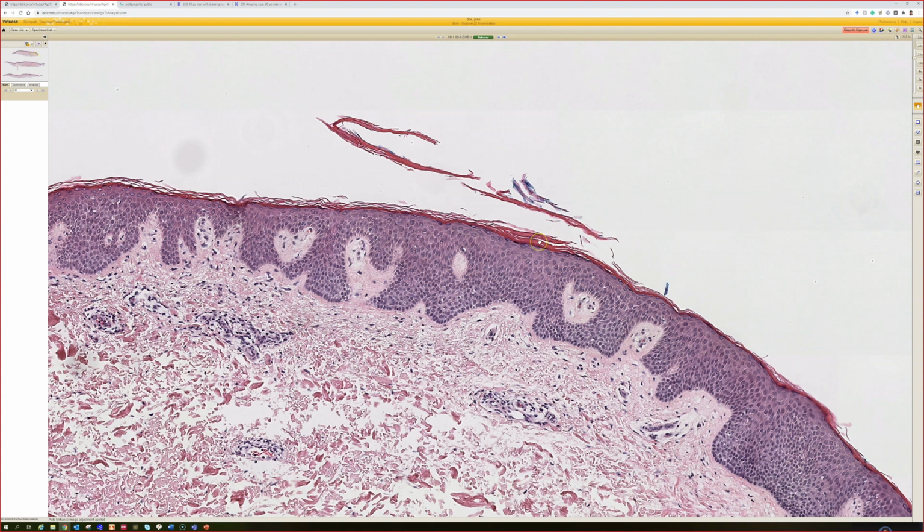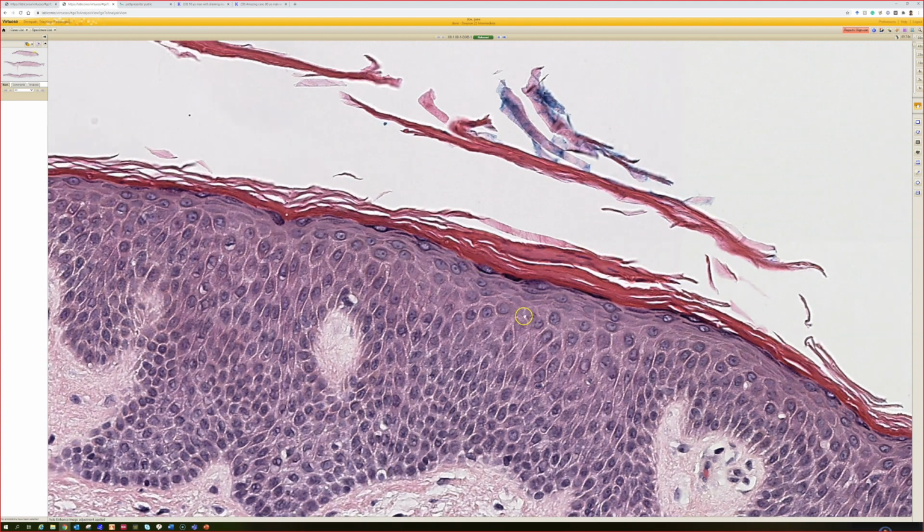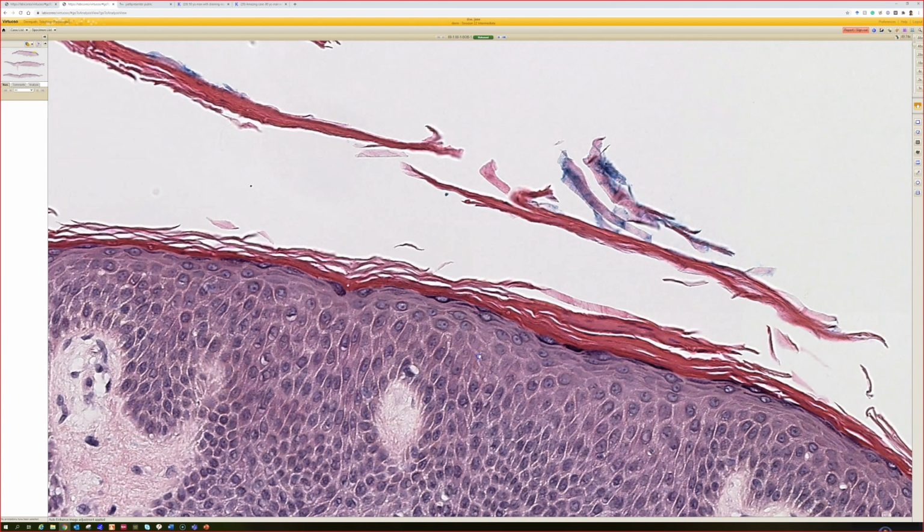One thing, though, if I see any skin that has a thickened layer of compact orthokeratin, see, the keratin here is thick and dense, and there's a little bit of parakeratin in there, but it's kind of thick and mostly just pink without nuclei. What should that make you think of? Maybe tinea. Yeah, dermatophytosis, tinea, often produces that thick, compact orthokeratin.